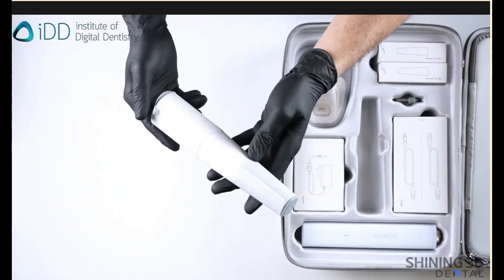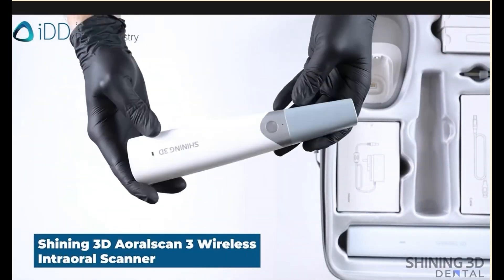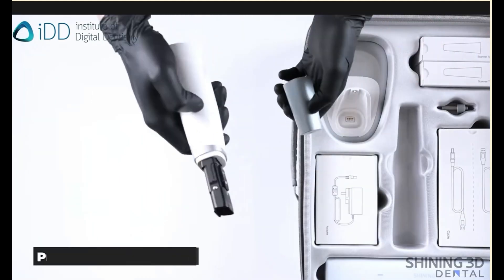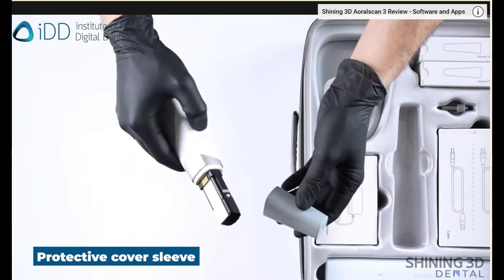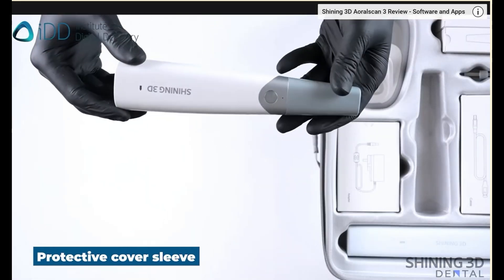Now let's start with the scanner wand. Always protect the scanner head. The actual scanner is delivered with a protective cover, which should always be placed when the scanner does not have a scanner tip in place.